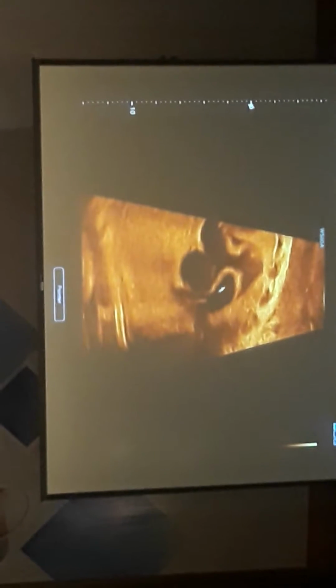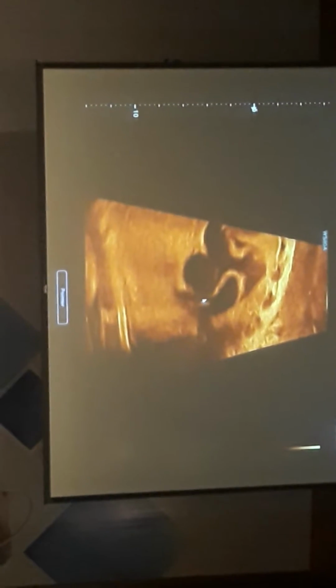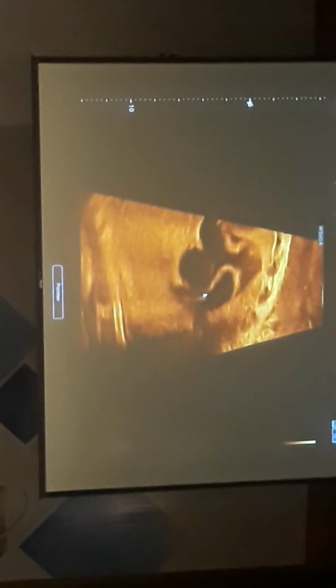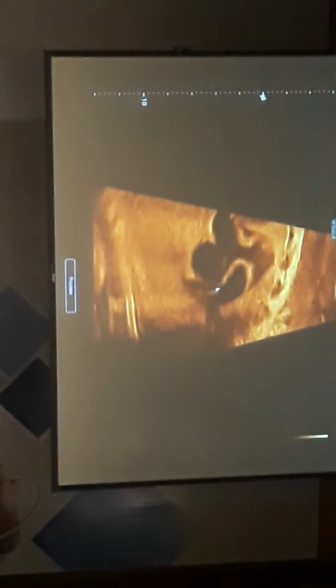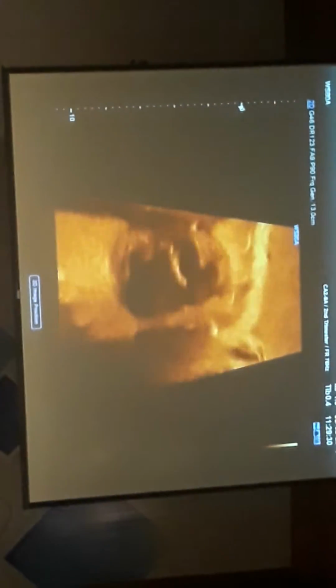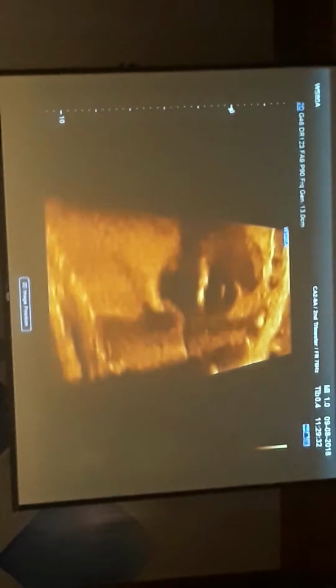So we could start to see the pulmonary artery, it bifurcates. But I need to see a trifid. I need to make sure the right and the left pulmonary artery come off, and the ductus. I haven't seen that yet. So it definitely takes two hands.